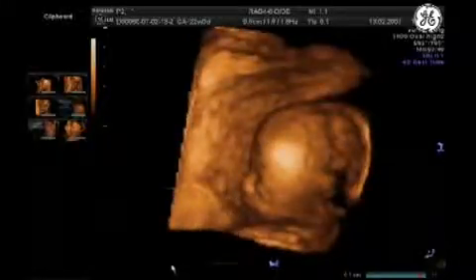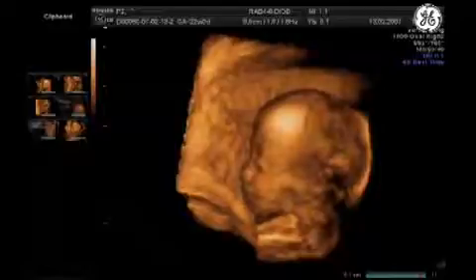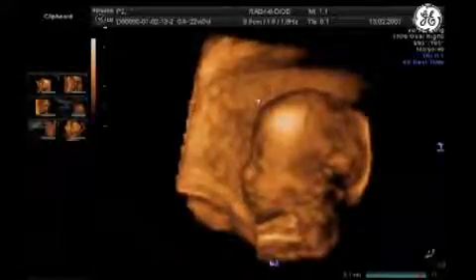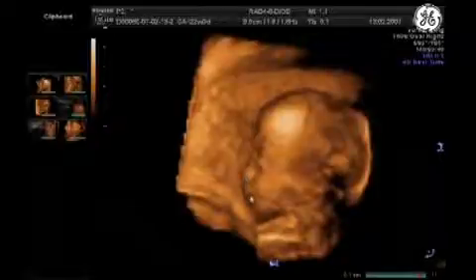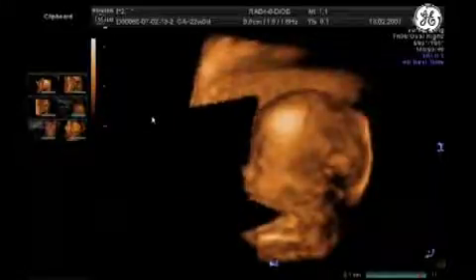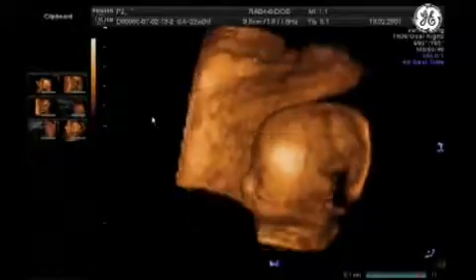And if you want to obtain the baby face with a black background, what you can do, don't try to use magic cut here, because if you do this, this is really difficult to obtain a nice face of the baby, and sometimes you may cut like this, and it's not nice. So you can go back. Last one. The best is to do like this.